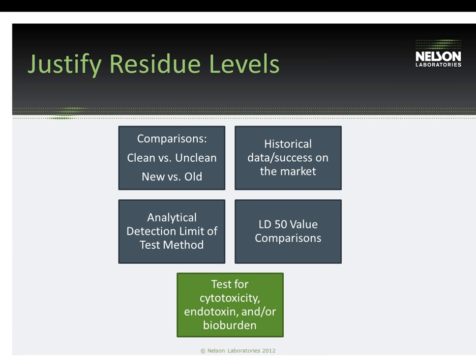It's often a predetermined number that you won't have to do testing for. But a lot of people will take that LD50 value, put it into a calculation that makes it comparable to these test results, and then they'll say if the result from the extract is less than the LD50 value that you've calculated, I have a pretty clean device. We see that that's very common in the industry, that a lot of people are using these LD50 value comparisons, and so we did want to mention that in this presentation as a tool that you could possibly use if you feel that that would work for you in your process.